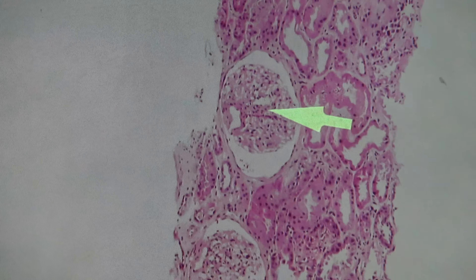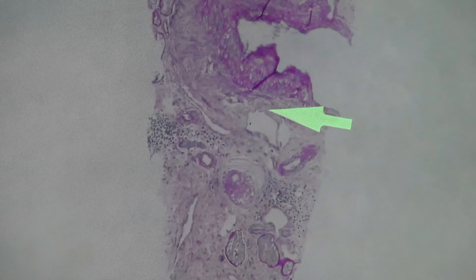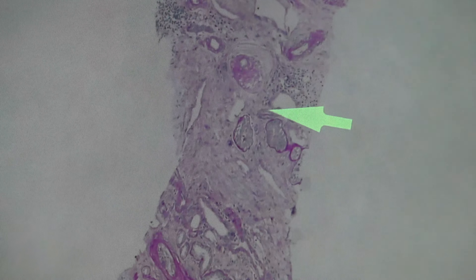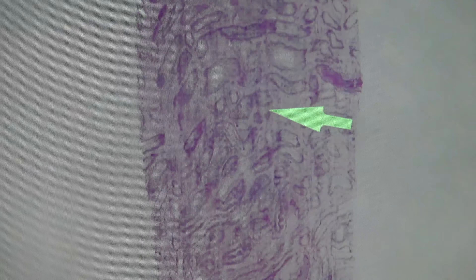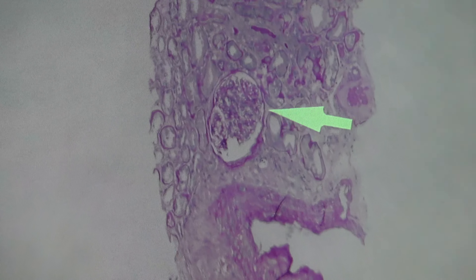Now we're going to go to PAS and look at that same core again. We've got much more detail now. Here is the medullary area with the medullary inflammatory infiltrate, then going up to cortex.